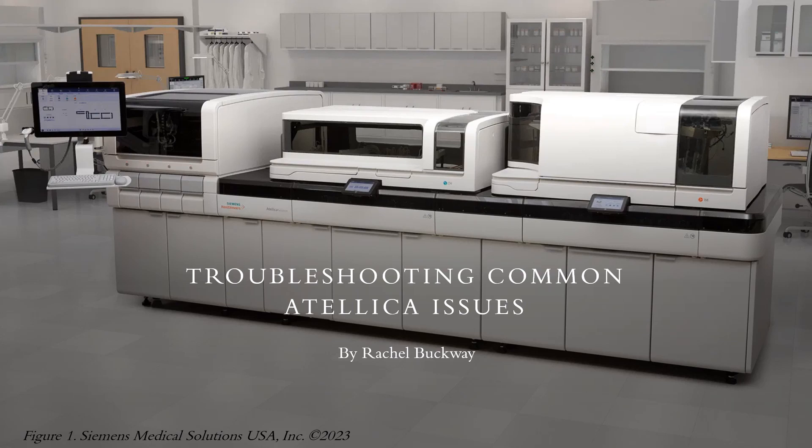Hi, my name is Rachel Buckway. I am going to be taking you through this video presentation of troubleshooting common Atellica issues. This presentation is designed to assist in resolving issues that occur with Atellica Solution analyzers to help you bring them back up quicker so that you're able to process samples again.